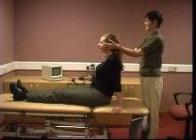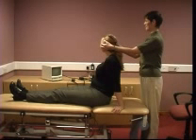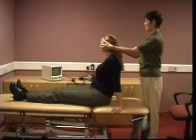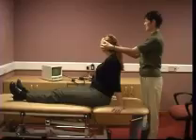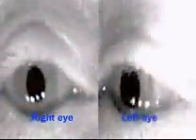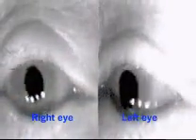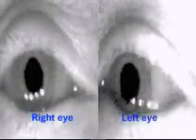Repeat the test with the patient looking the other way. This is an example of right sided BPPV.